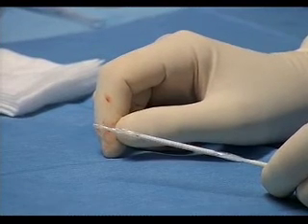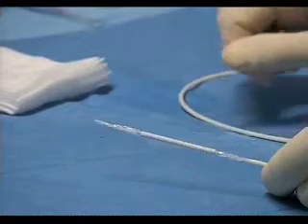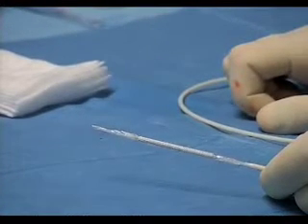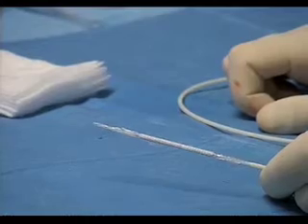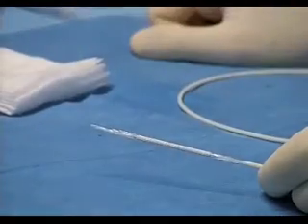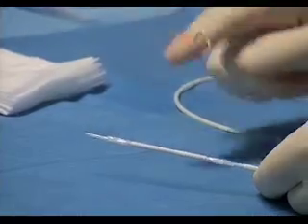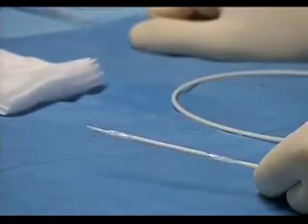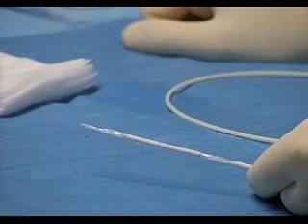That is good enough also because if you are to redilate the stent immediately, or maybe in the near future in order to allow some growth of the patient, we have the possibility. The open cells design gives us the chance to adapt the stent to the anatomy because it's a very soft one.